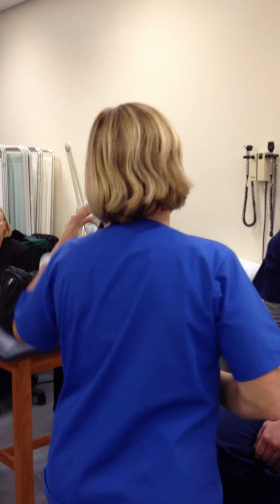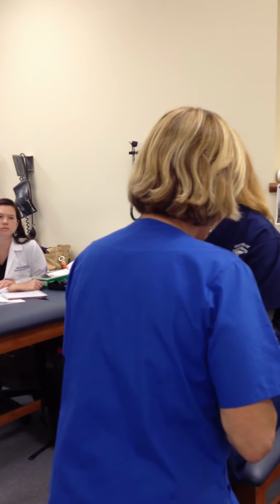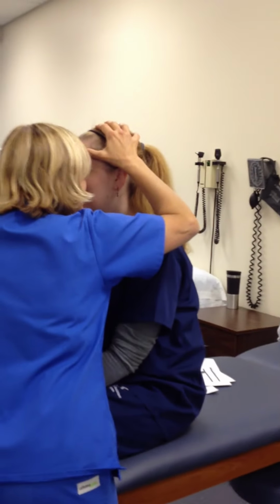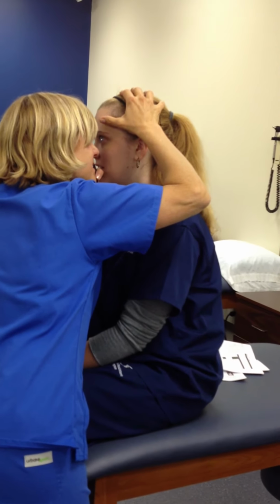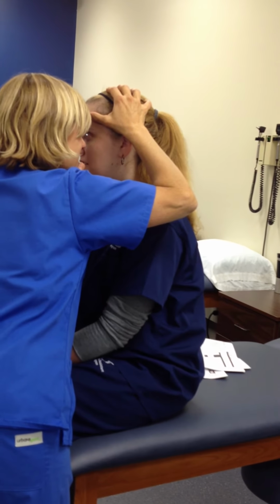And then when we go to the other side, for the test, you don't have to say all those things again. You're gonna say, and I'm gonna do the same thing for this eye. I'm gonna do it a little bit. And look right up.